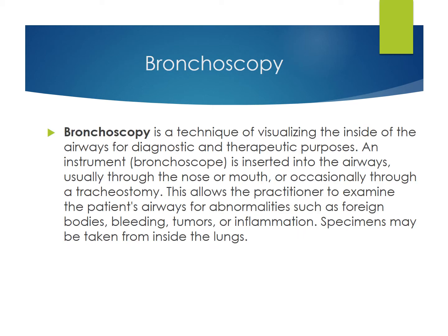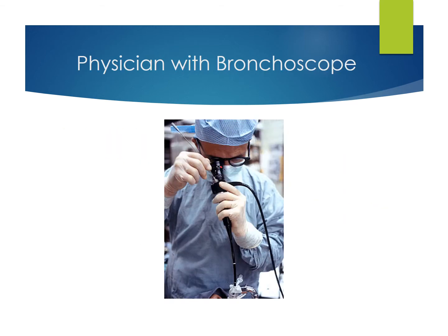Bronchoscopy. A bronchoscopy is a technique of visualizing the inside of airways for diagnostic and therapeutic purposes. An instrument, a bronchoscope, is inserted into the airways, usually through the nose or mouth, or occasionally through a tracheostomy. This allows the practitioner to examine the patient's airways for abnormalities such as foreign bodies, bleeding, tumors, or inflammation. Specimens may be taken from inside the lungs. This is a physician with a bronchoscope.